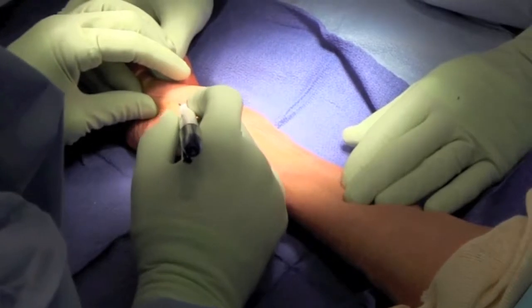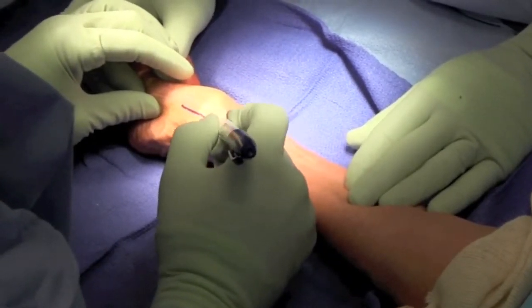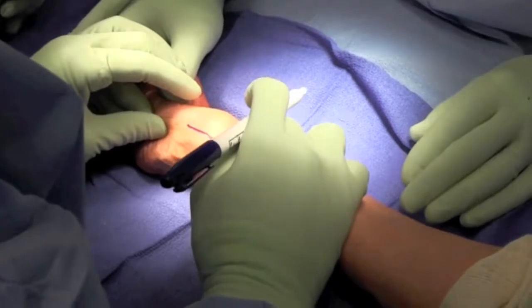This is our patient. We're marking along the radial border of the first metacarpal using an L-shaped incision.